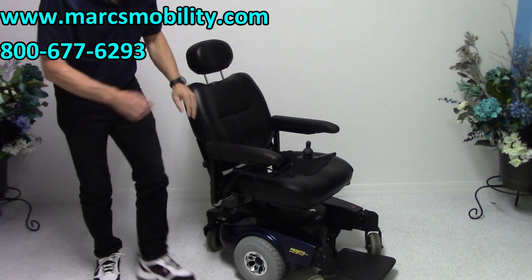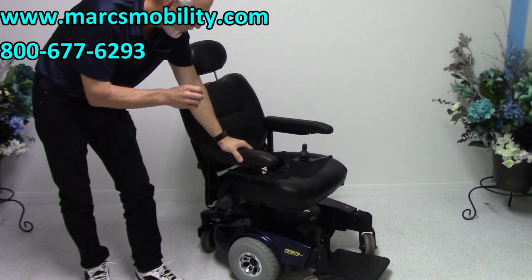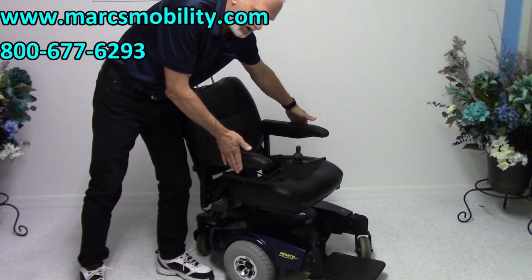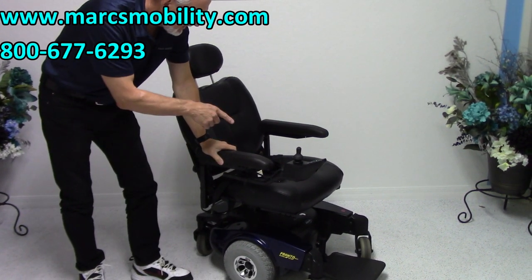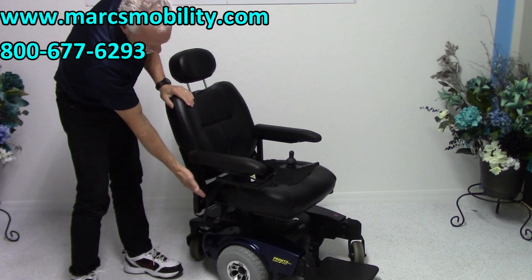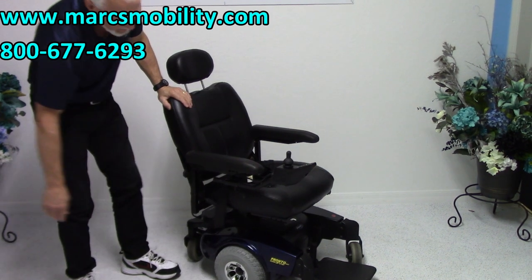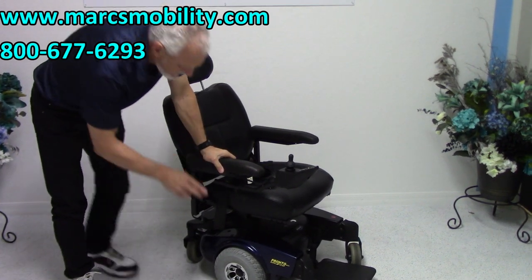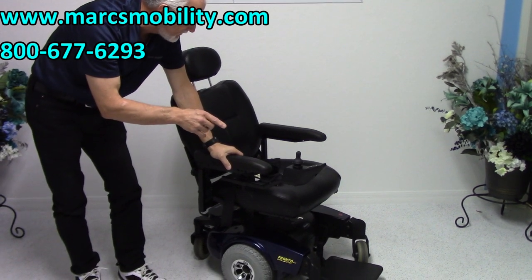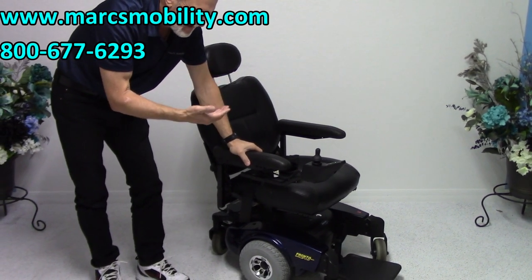So this is the Pronto M51 power chair. The total width of this chair is about 24 inches. The seat is 19 by 19 — it is a captain's seat, adjustable. You do have your safety belt, that great suspension, 10-inch solid tires, and an adjustable foot plate. This is a really nice basic power chair.